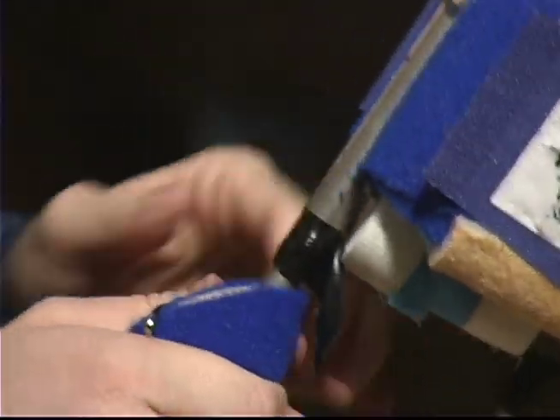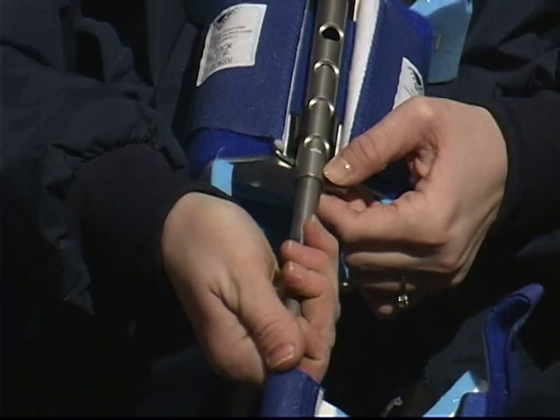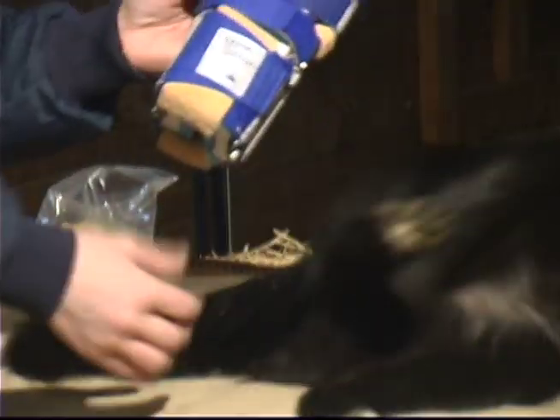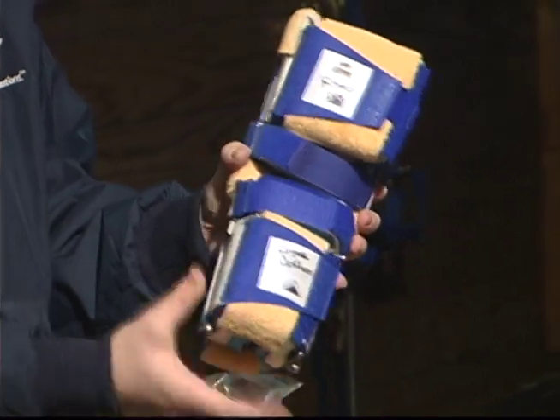What you do to one side, you must do to the other. Some Dynasplint systems have a pull pin and lock adjustment — simply pull the tab and slide the struts within each other until they click and lock into place. The proximal and distal struts on the extra small and small Dynasplint systems are not adjustable.